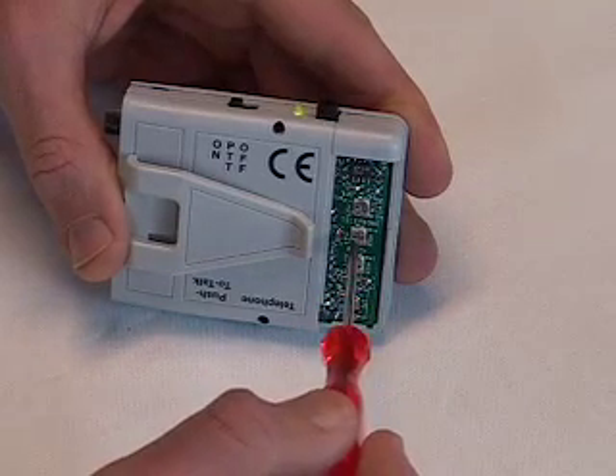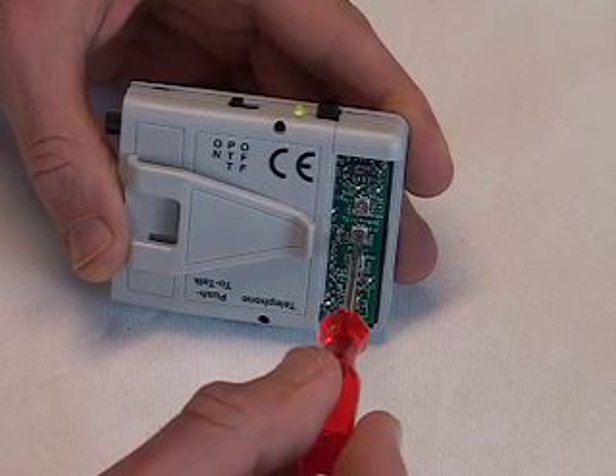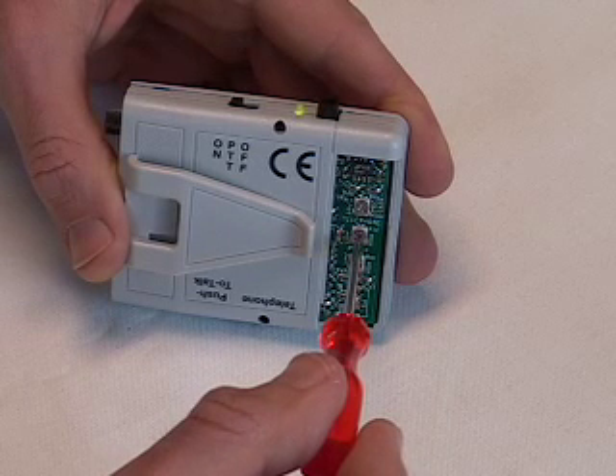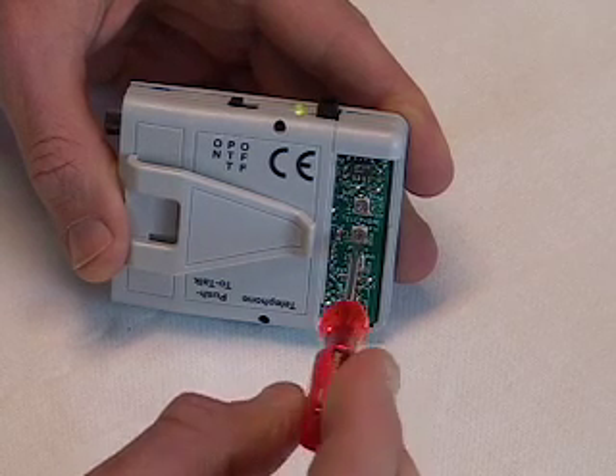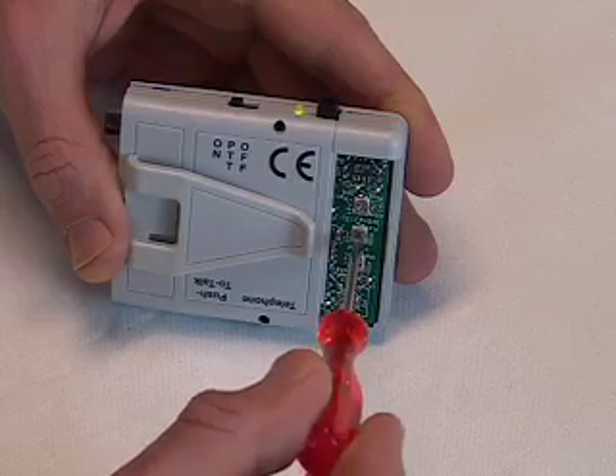The middle control is the outgoing telephone volume. Ask people if your voice is too loud or too quiet on the phone, then adjust this control. Increasing telephone volume is especially helpful if you have Parkinson's.